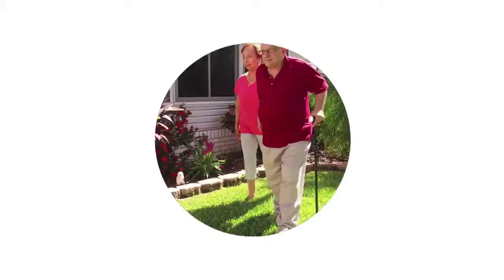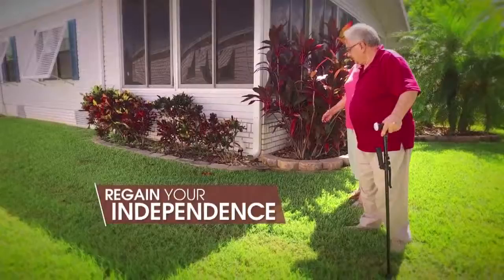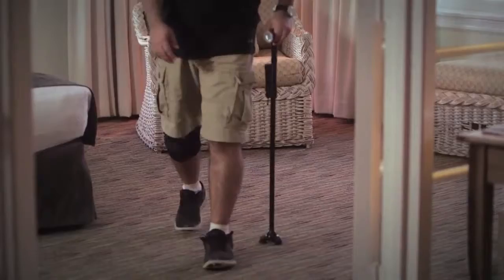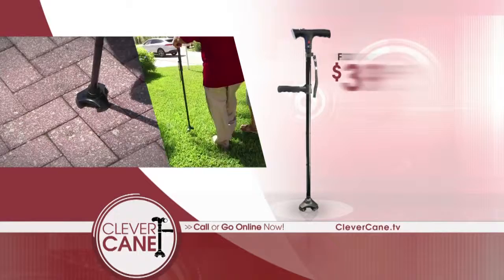You can enjoy your newfound freedom and mobility and regain your independence with the Clever Cane. Maybe you just suffer from back or neck pain or have a sports injury and need the extra stability. The Clever Cane is rehabilitation specialist approved, so it's the perfect tool to help you take the next step during recovery. Get your very own Clever Cane today for only $39.99.